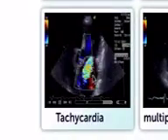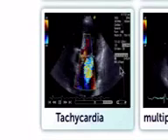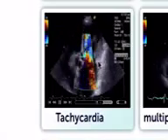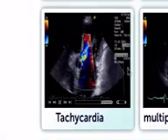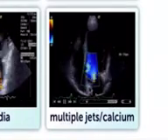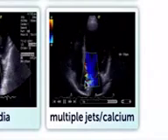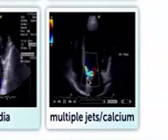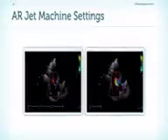Another problem that you encounter sometimes is in patients who have a very high heart rate. You can note here that the jet is very difficult to see because diastole is so short. So this also makes it quite difficult at times. Another example we saw previously is heavily calcified valves do not allow you to see the portion of the jet which lies above the aortic valve. So you cannot look at the flow convergence zone and you do not see the vena contracta.